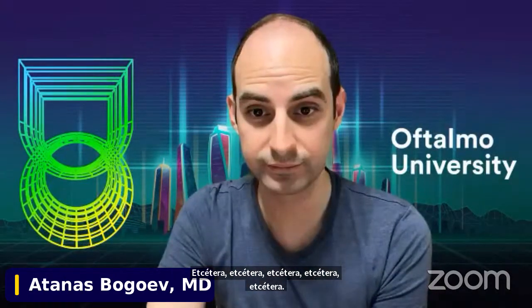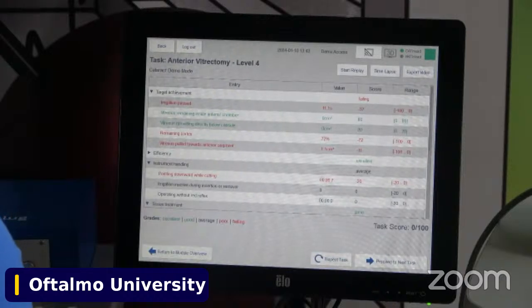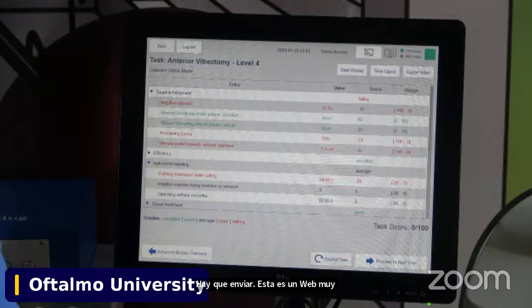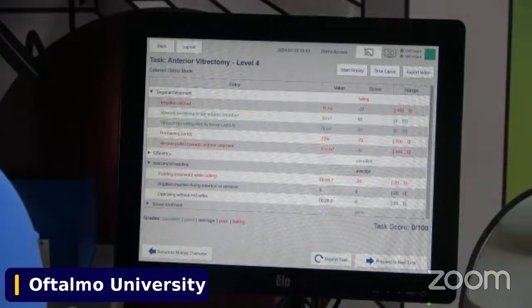I agree, yeah. So let's talk about this. Andrew, on purpose, did a couple of mistakes, but actually I can be honest, that is what we mostly do in the beginning, right? Basically, when we're doing vitrectomy, we see vitreous, we go for vitreous, and we don't take the most important principles into account. So Oliver here is going to explain what happened with all those metrics. I hope you can read them.